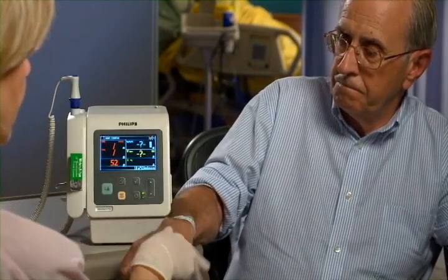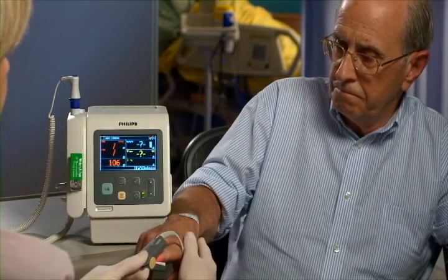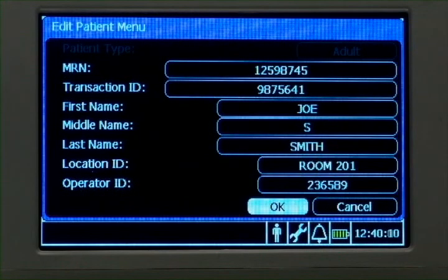This section explains how to perform non-invasive blood pressure (NBP), SpO2, and temperature measurements. After entering or selecting a patient ID, you can take vital signs measurements in any order.